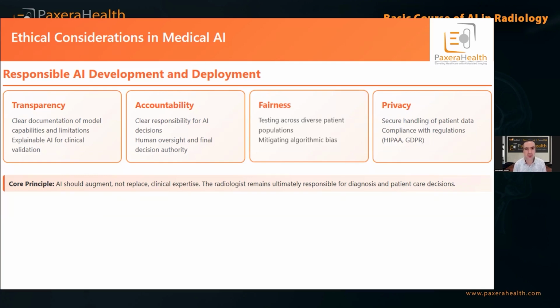You can't provide an algorithm that was trained on normal chest X-ray screening and then apply it to test data full of other things and objects that can confuse the algorithm. So it's very important to know how the model was tested and used, and what the right application for it is.